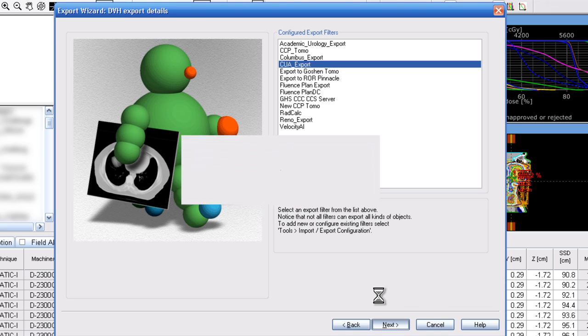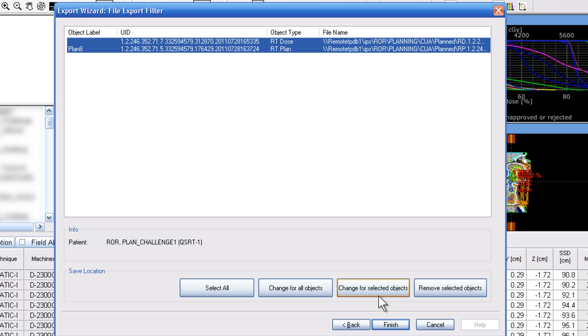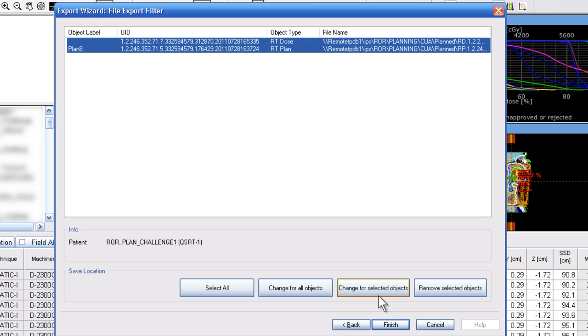It will go through the process here and assemble the required files. You should see an RT dose file and an RT plan file. Those two are the only ones that we need now to verify the submitted plan.